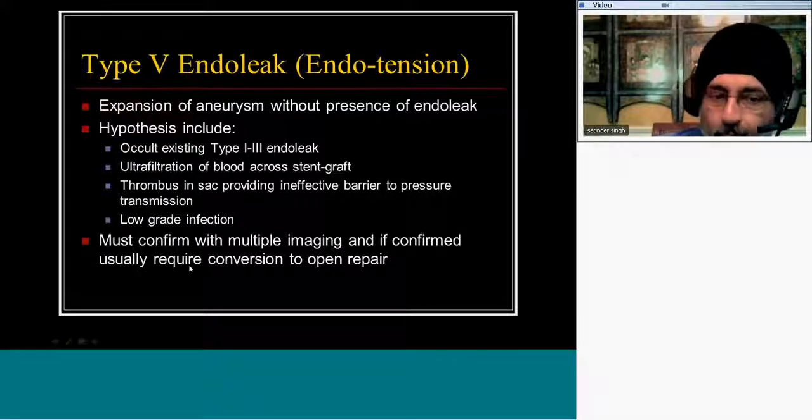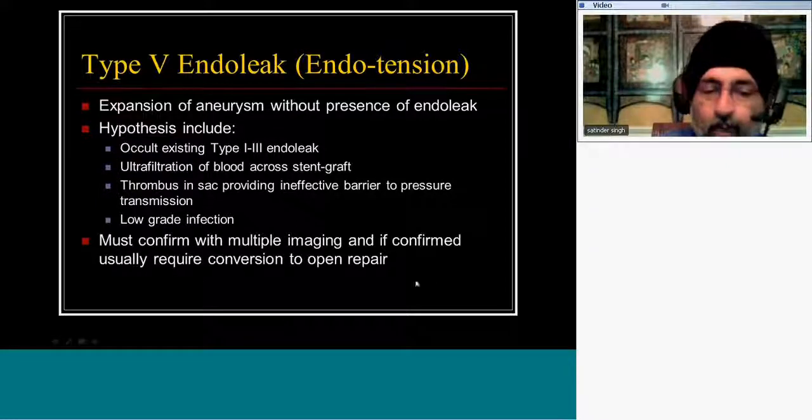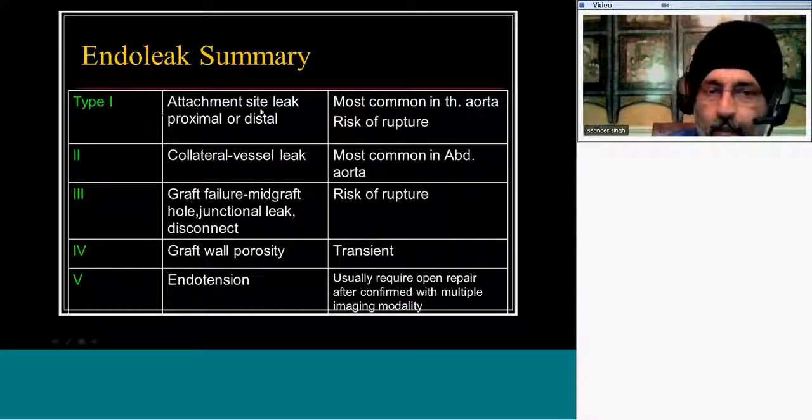So the best thing for us to do would be to confirm with multiple imaging studies and compare with old studies to see if the sac is expanding. If it is confirmed that it is definitely expanding, this often requires open repair. So here is a summary of different endoleaks.